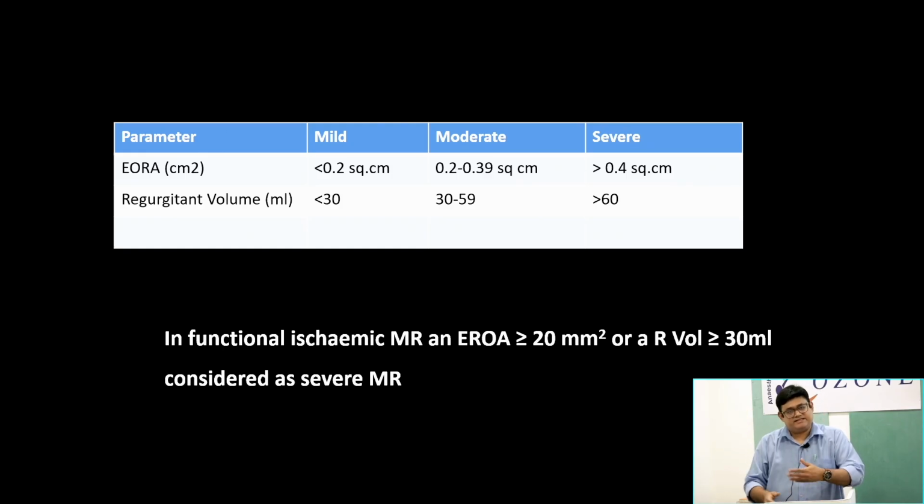It is not that easy where a very fast surgeon is there, and if he goes on bypass in 15 minutes and you are still doing your measurements, it becomes very difficult. So only in cases of dilemma, or where the pictures don't match, you will go ahead with all these quantification methods. But its advantage is that it is the only quantification method available for MR.